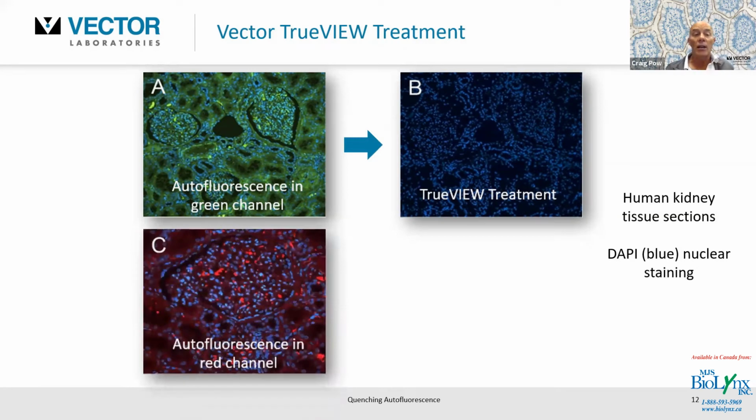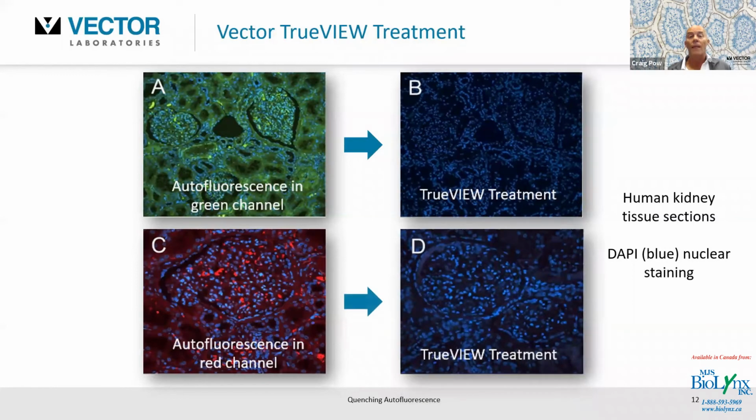Here it is in the red channel, again, human kidney, and counterstained just with DAPI, no other detection reagents in there. You know, the red marks that are in here is all autofluorescence. So what happens under the red channel when you treat with TrueView? Again, the autofluorescence is eliminated, and the retention here of the DAPI provides a bit of an idea about that underlying morphology, and certainly then would allow you to clearly identify your red signal.